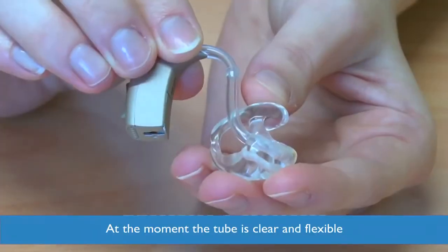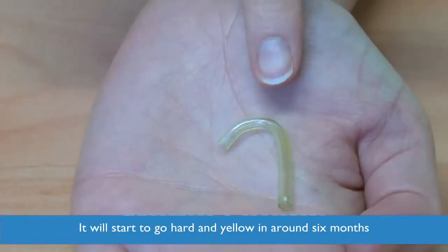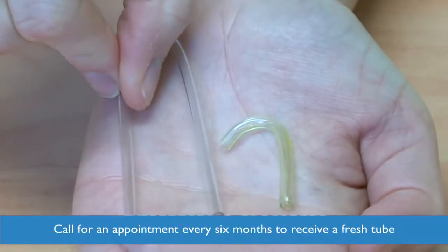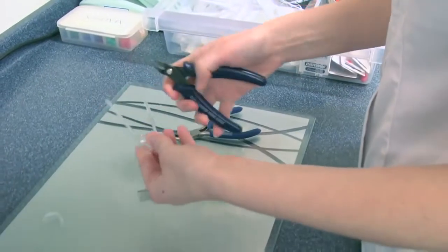At the moment the tube is clear and flexible, but it will start to go a bit hard and yellow in around 6 months' time. This can affect both the sound and comfort. Please call for an appointment every 6 months so we can change it for a fresh tube.